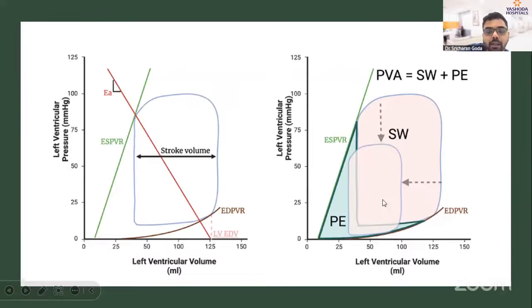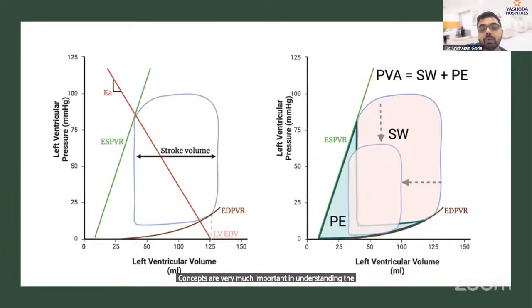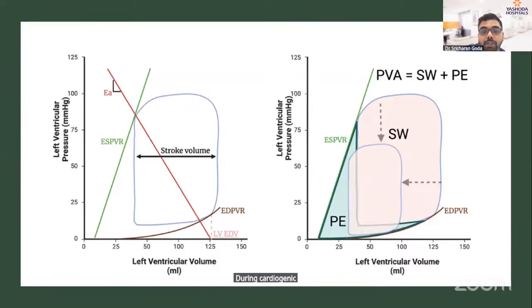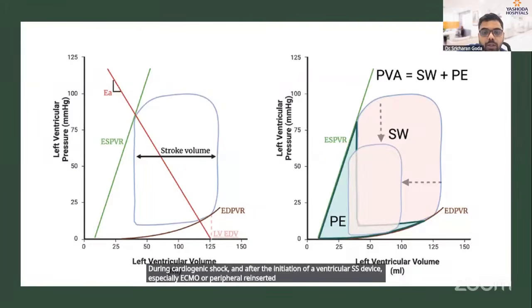These concepts are very important in understanding the dynamics of the left ventricle during normal function, during cardiogenic shock, and after the initiation of a ventricular assist device, especially ECMO or peripherally inserted ventricular assist devices.